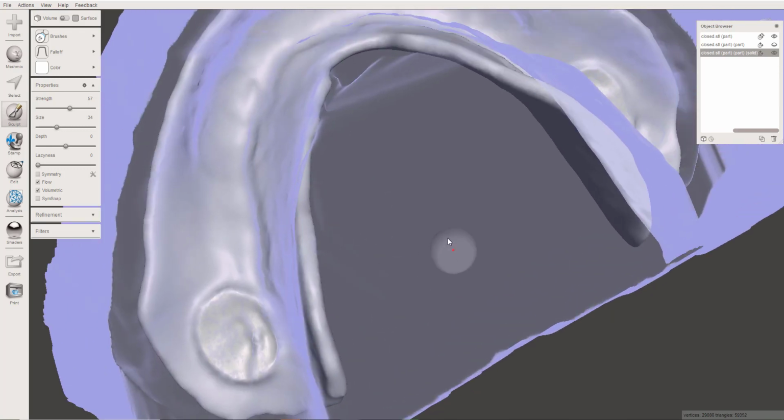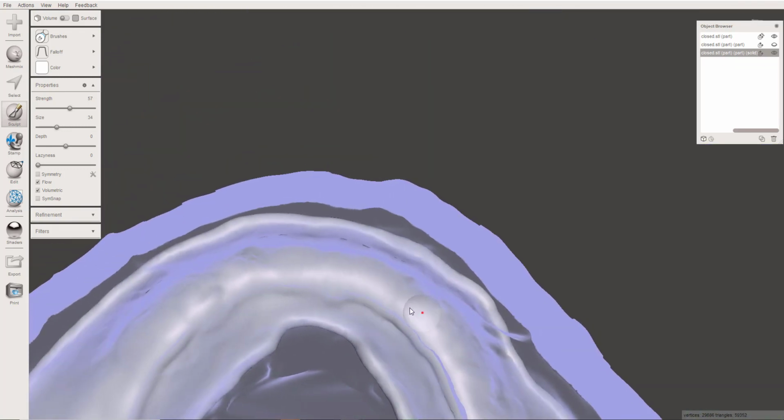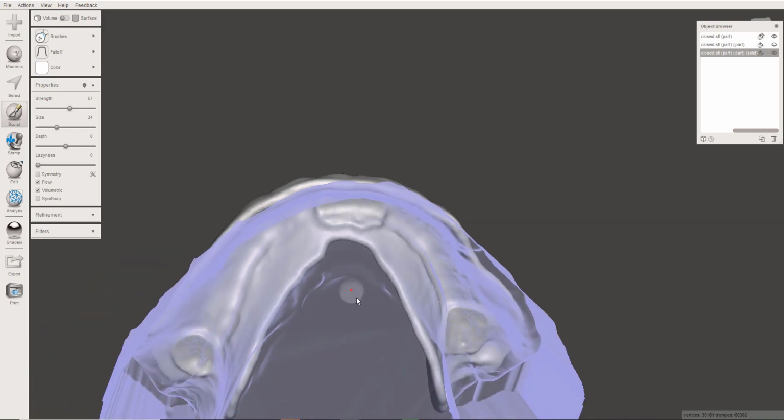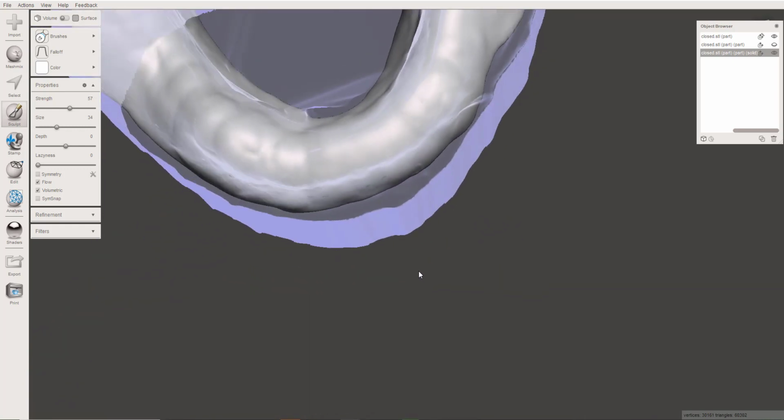So now we have another tissue stop, and let's get a tripod of stops. So I'm going to just do the center of the ridge here. So make it whatever you want. If you like different spots for your tissue stops, that's the beauty of digital, is you can just do whatever the heck you want. You're not beholden to anybody else.